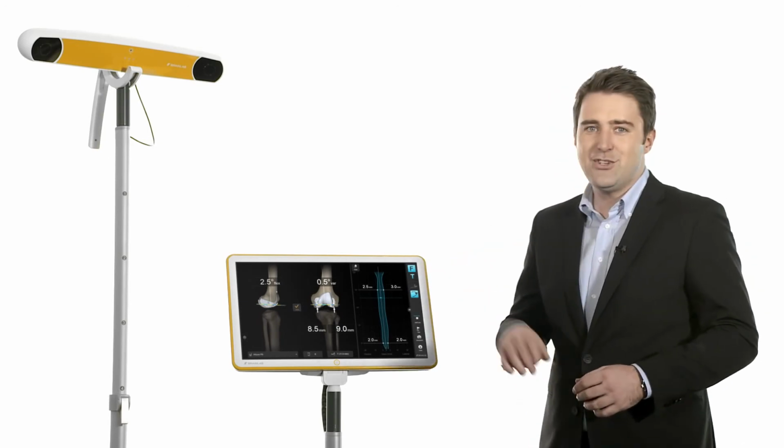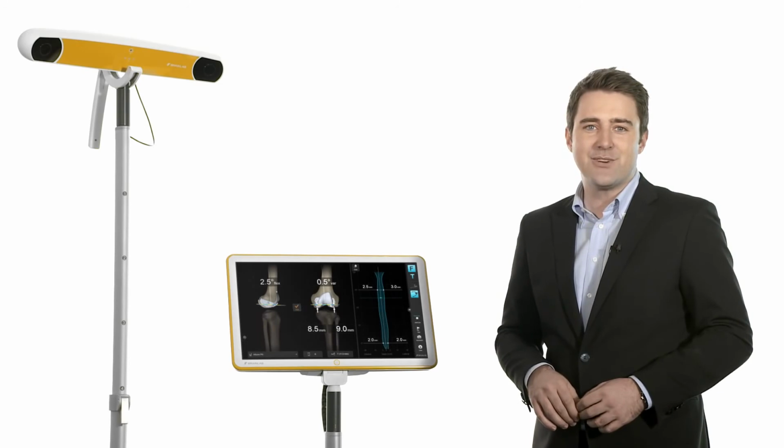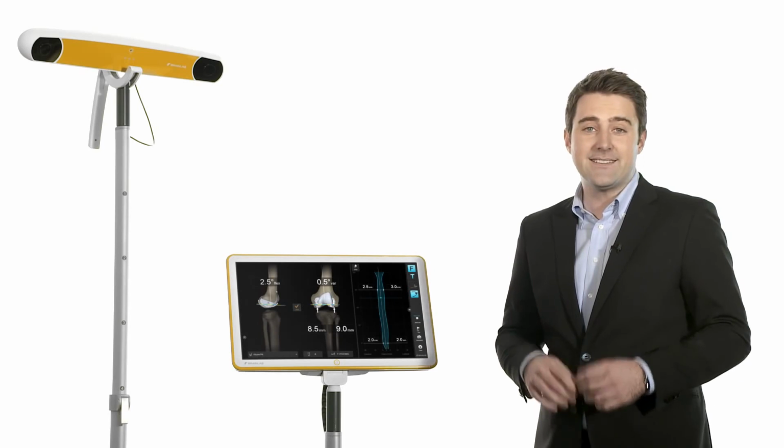Knee 3 marks a new generation of software-guided knee surgery, which places the power and control of orthopedic navigation in the hands of the surgeon.